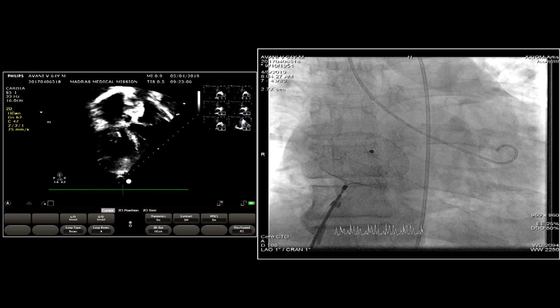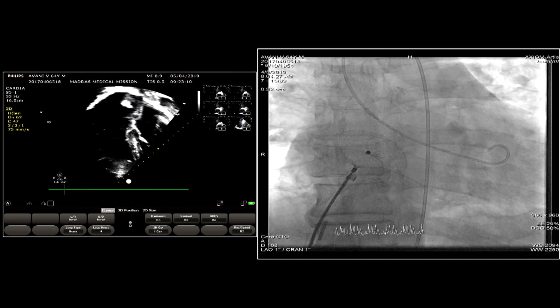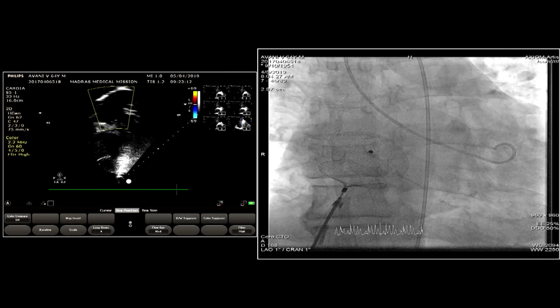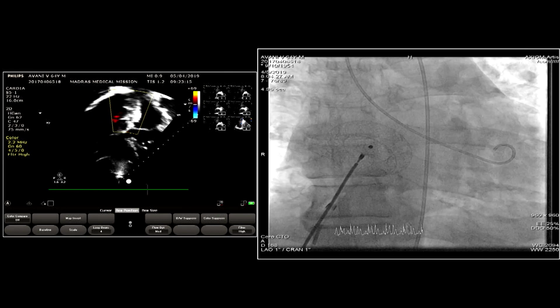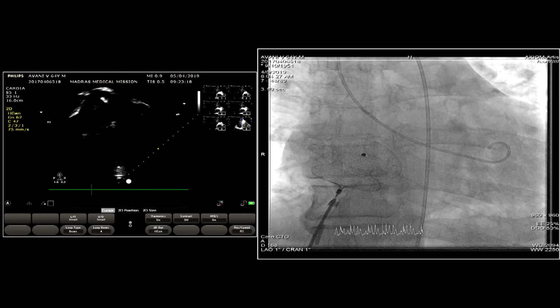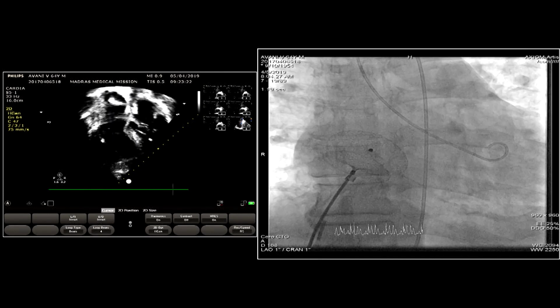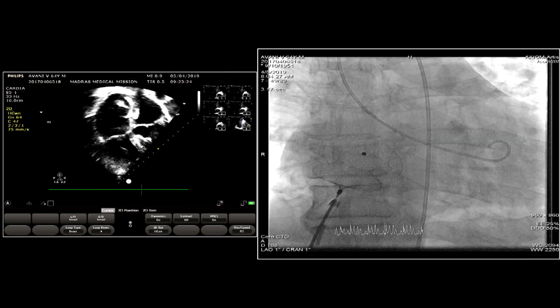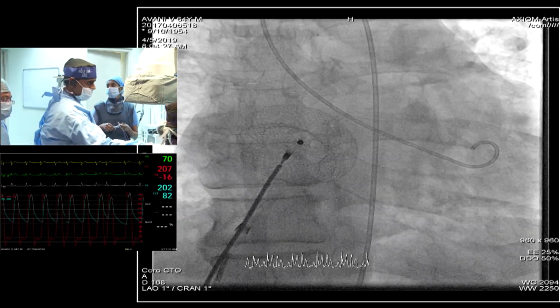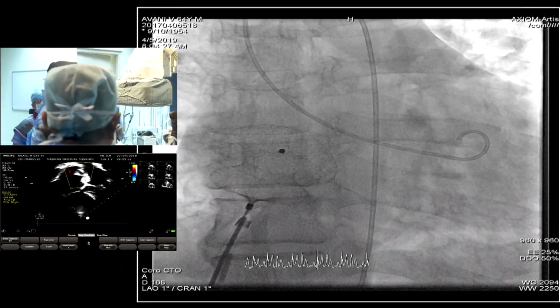So Dr. Sivakumar, when you are closing this, if you find some of the margins have fairly flimsy borders, in those scenarios do you go with 3D imaging sizing or would you balloon size? That's where I find that balloon sizing becomes useful. I agree, because it gets much bigger than what we expect on an echo. Yeah, we stopped balloon sizing about 12 to 13 years ago.